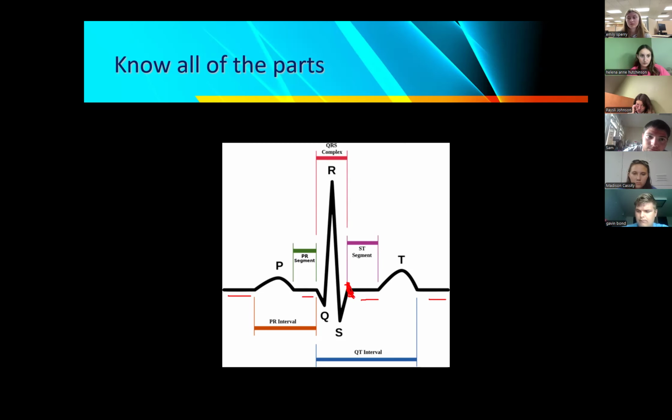Now, we're going to talk about the importance of why you need to be able to identify it in this particular class. But when you get in advanced cardiology, that J point is going to become critical for you to be able to identify and to measure, because that's how you're going to tell whether your patient is having an MI based on what we see on our EKG.